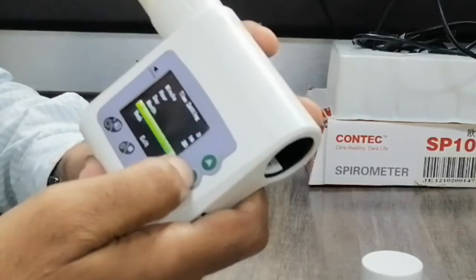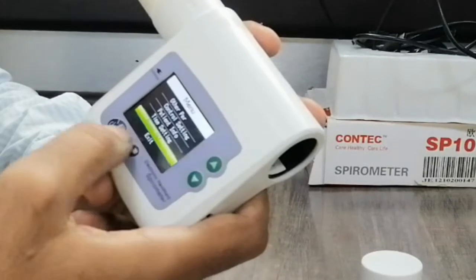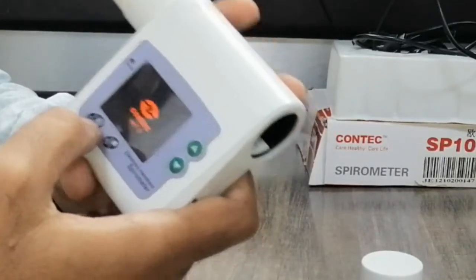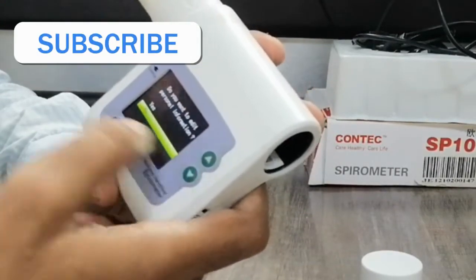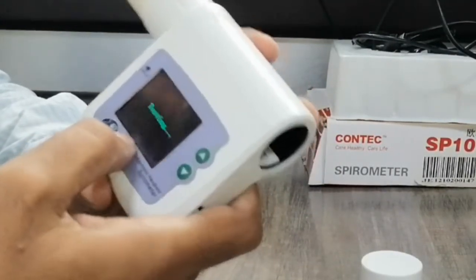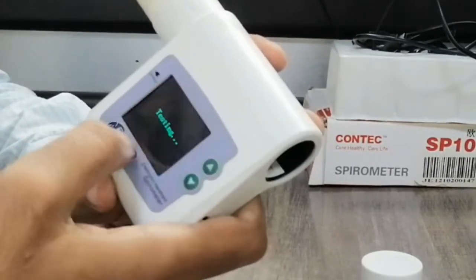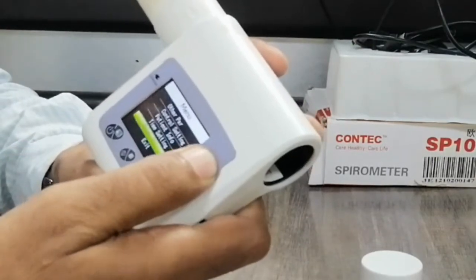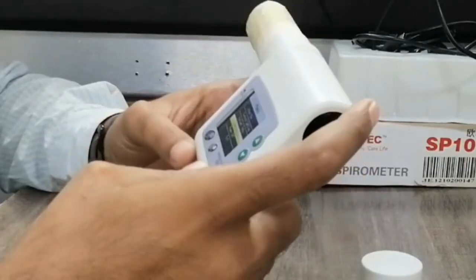Here is the power off button — you can press this and the machine will power off, or it will automatically power off after a few seconds of inactivity. From the exit screen, you can press this and the main screen will return to testing mode. This covers the basic parameters and functions of this spirometer machine. Hope you learned about it.